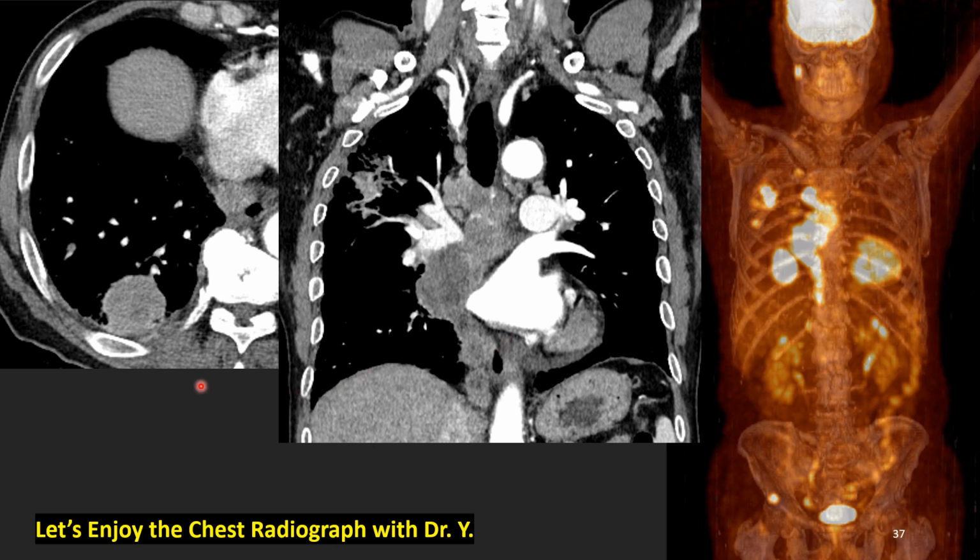These are the initial images of a CT and PET CT. This is right lower mass of small cell lung cancer, extensive conglomerated lymph node metastasis, and presumed right upper lobe adenocarcinoma. At the PET CT, we see small cell lung cancer, lymph node metastasis, and presumed adenocarcinoma here. Are they all? No, we have more. Pelvic bone metastasis at first glance, and another lesion here. This is small cell lung cancer. Small cell lung cancer is so unhappy, usually unhappy.